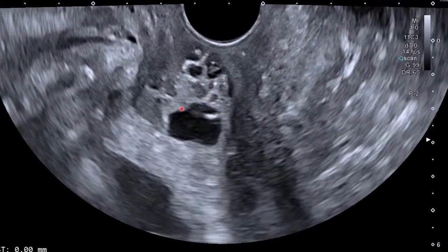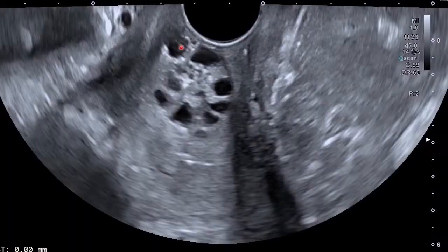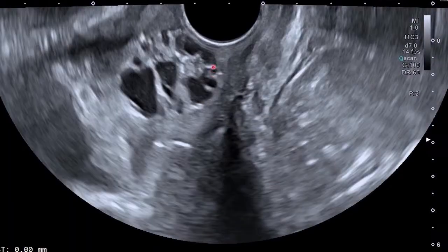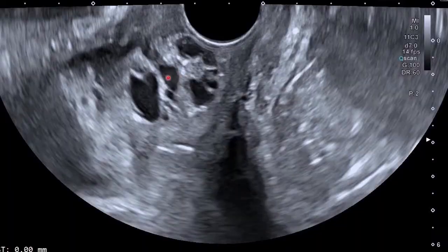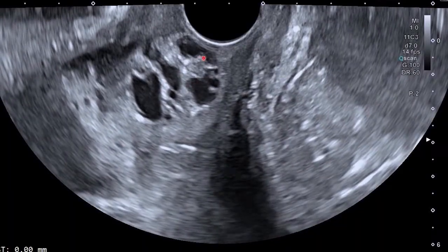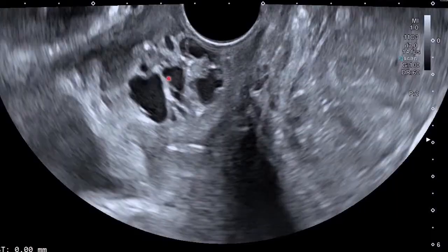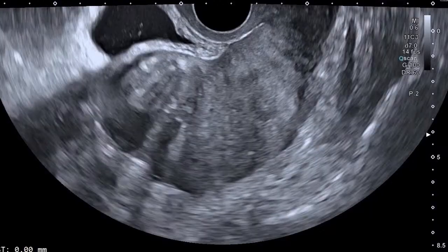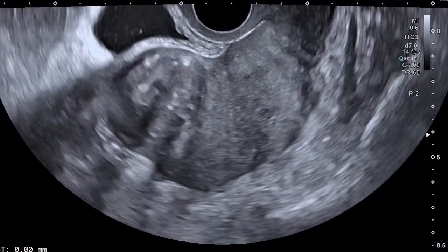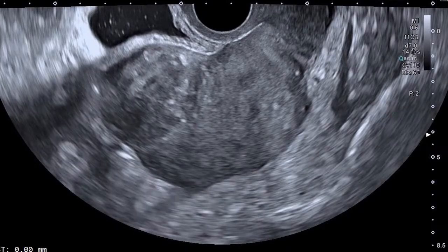So what's your take? Help me, guys. I am also stuck. But there's no flow, you know. There's some internal movement there. This is the kinetic energy from the probe, you know, that these particles are now moving inside this, but they are not blood vessels. So let's do it together under the comment section. Give me your thoughts. Thank you so much.